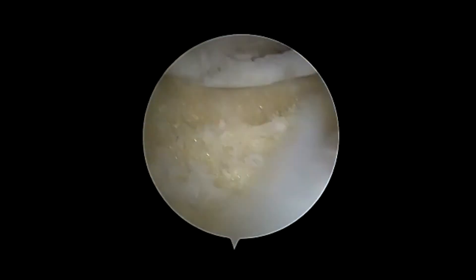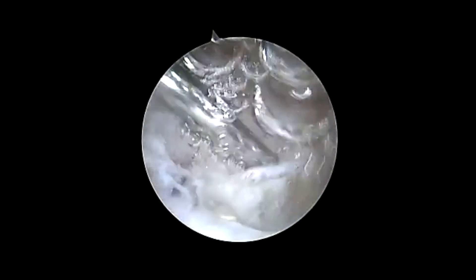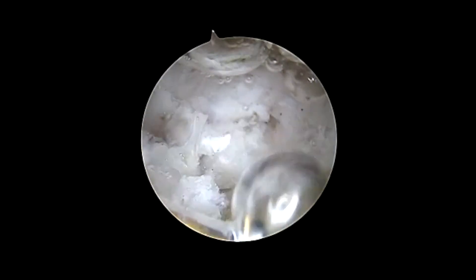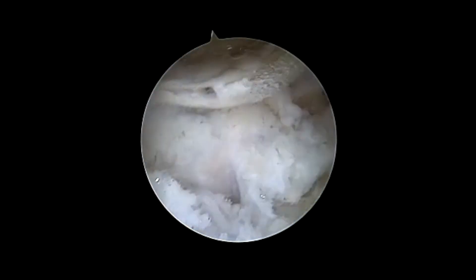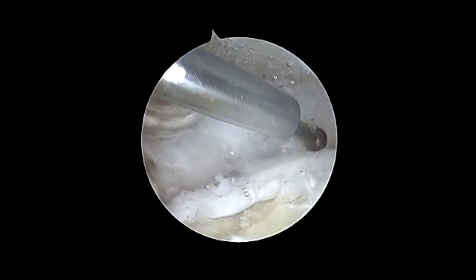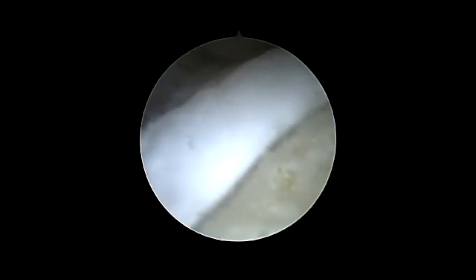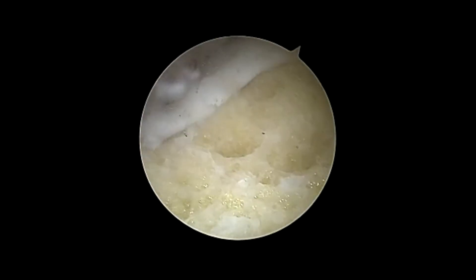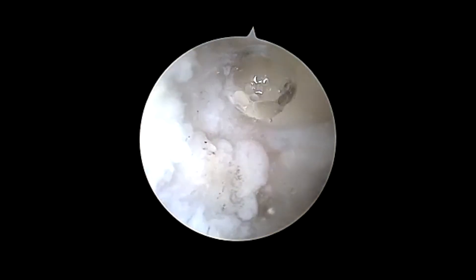Once the arthroscopic hemi trapeziectomy is completed, a Smith & Nephew microablator thermal probe is used in order to perform a basal joint capsular stabilization. A final inspection of the joint is performed and the arthroscopic shaver is used to ensure that there are no residual loose bodies or synovitis left in the joint.